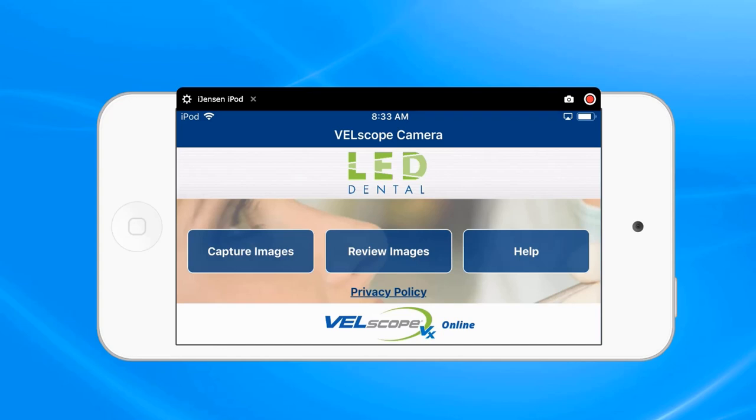We are now going to review how to transfer an image from the iPod Touch to a computer, and specifically to a folder on the computer that can then be put into a patient's record.